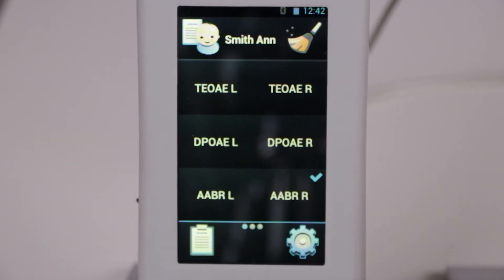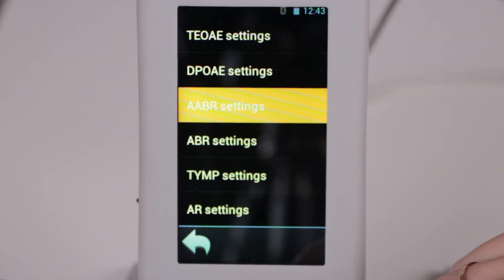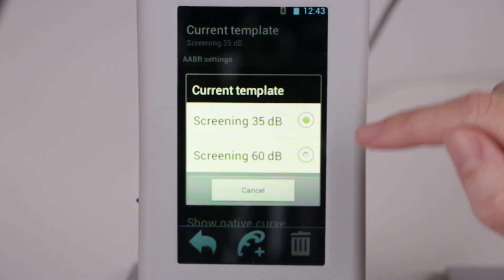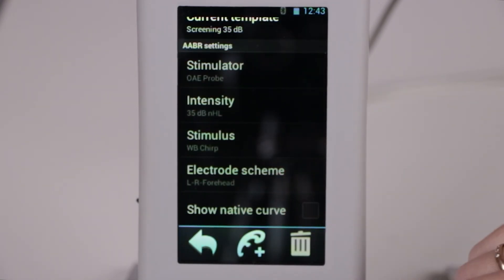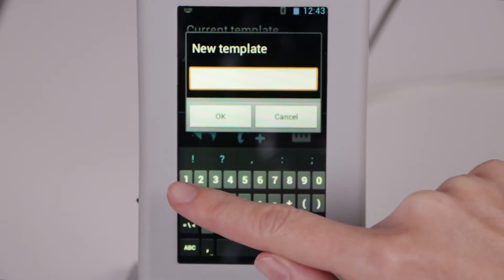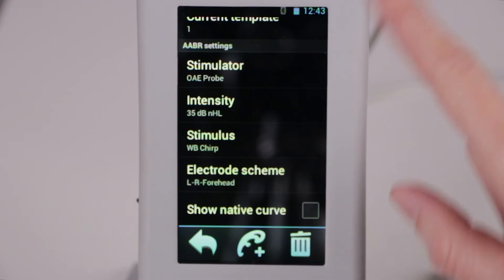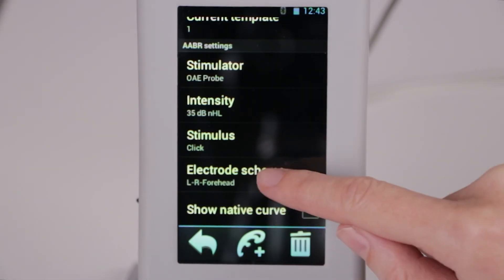Now, a few words about test template setup. Go to the setup menu and choose test settings. Let's start with the AABR default templates — we have two different default templates with different intensity levels of stimulation; other features are the same. You can't change anything in the default template, but if you want to change something, you should create a new template. After that you can change parameters such as stimulus type or electrode settings.